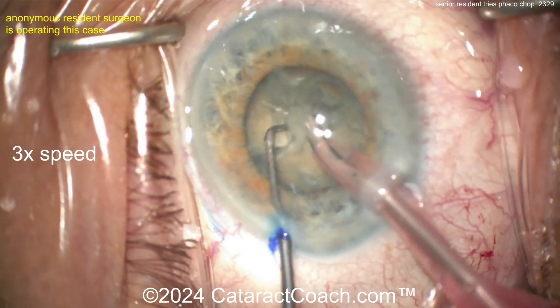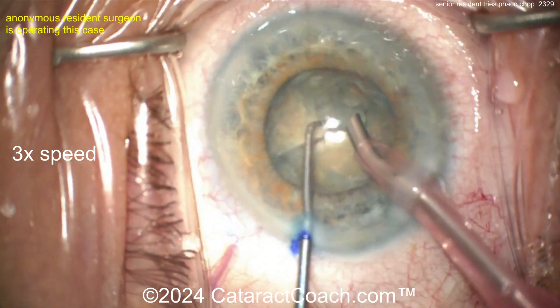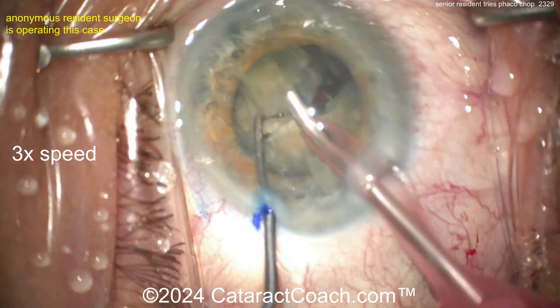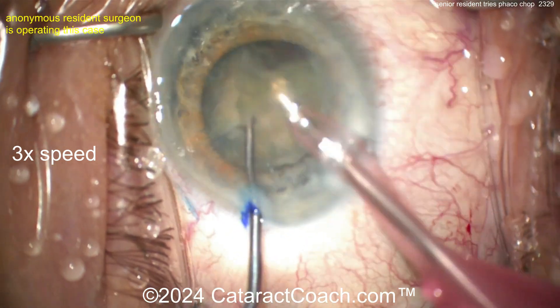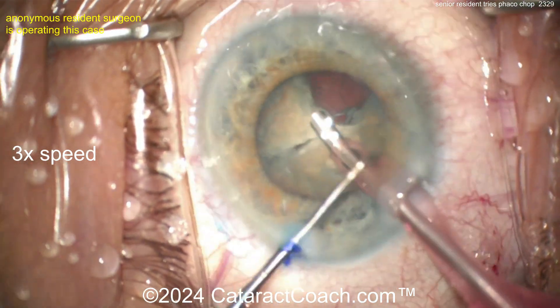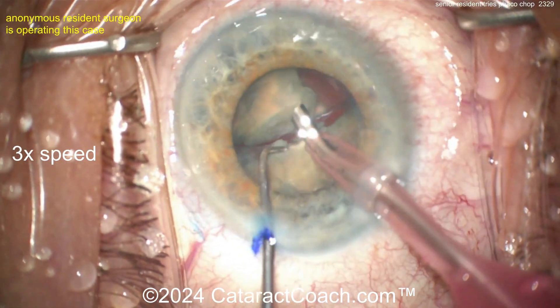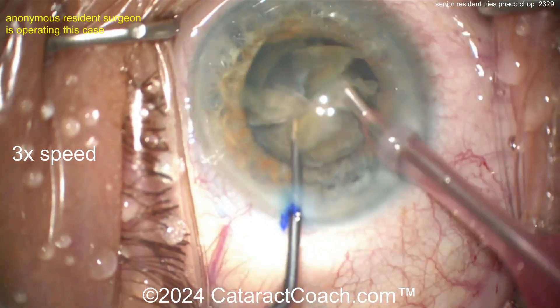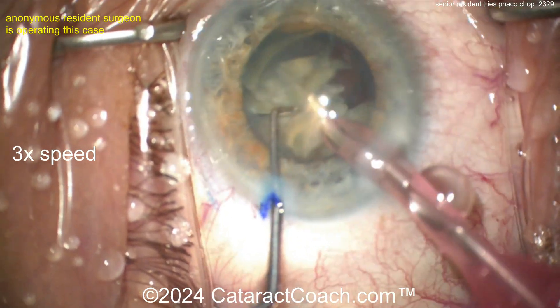This is not a beginner — you've done a lot of cases, let's be honest. You're doing a beautiful job and I am impressed. I'm guessing this is at least case 100, if not case 200. If this really is case 50, whoever you are — fantastic job, you are gifted, you have incredible hands.